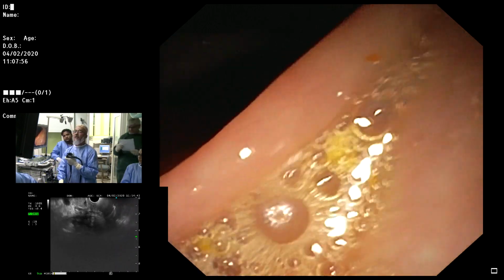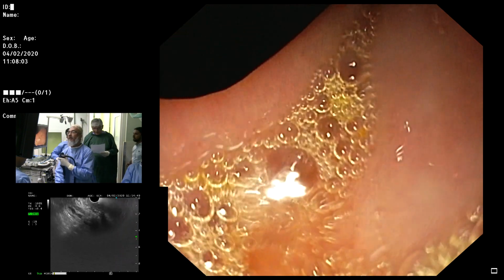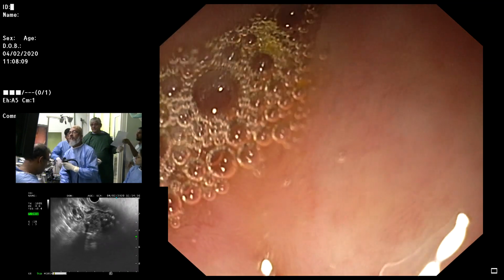Okay, sorry Khalid, the CT scan is actually, that was the next door patient. It shows chronic pancreatitis with atrophic distal pancreas, dilated channels, but no evidence of mass. No evidence of this. Okay, so where are we?